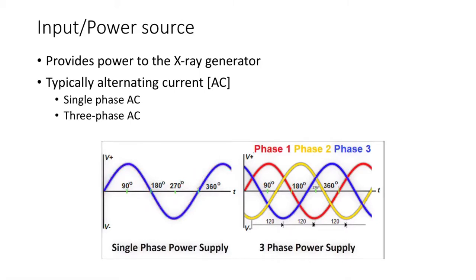And note, this current is first moving in one direction. Notice it's got a positive voltage. But then on this part, it's moving in the opposite direction. So if this was moving forwards, this would be moving backwards.